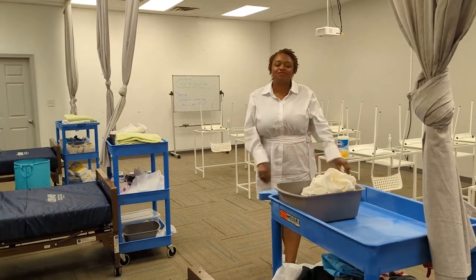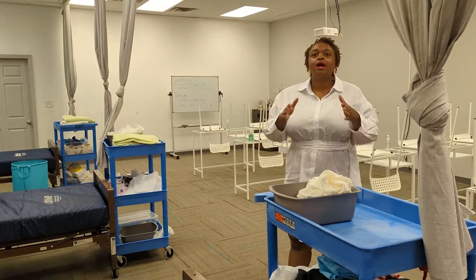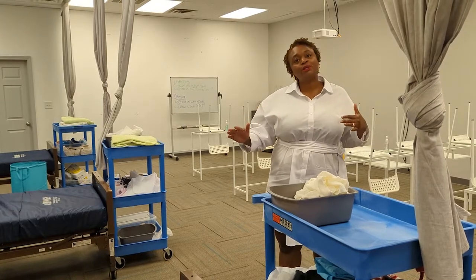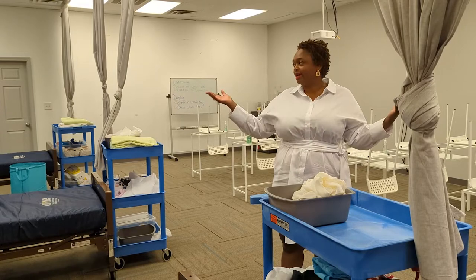Hello everyone, this is Stephanie Victoria here. I am doing a quick demonstration of applying anti-embolism or TED stockings. We're going to go through the whole entire thing — this isn't a long skill at all. We're at Health Care EDU.